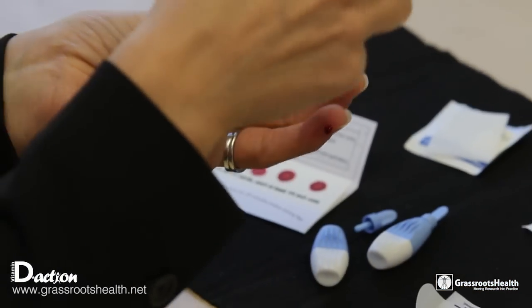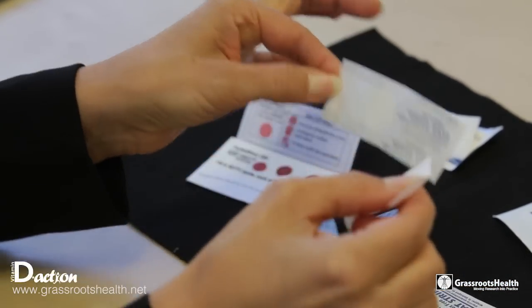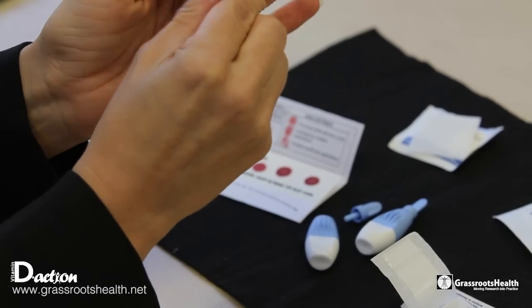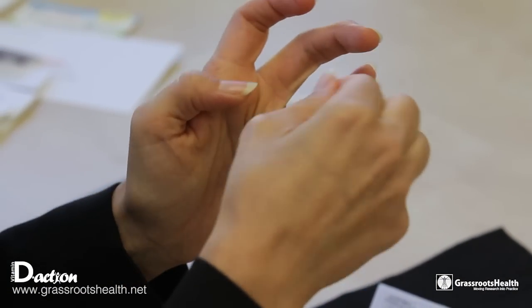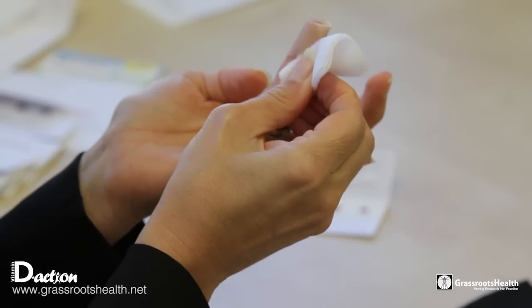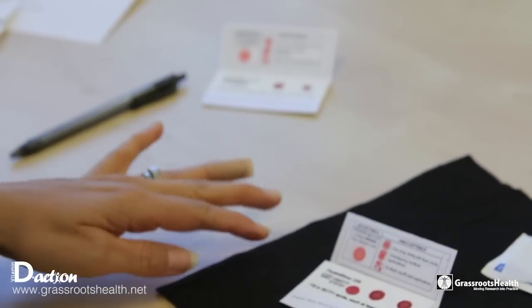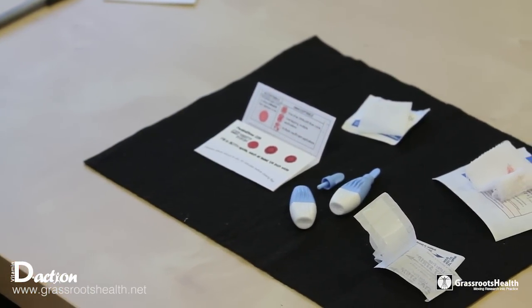Now we can apply the band-aid to your finger, which you can wear for 30 minutes or an hour or however long you wish, just to keep the blood from flowing. Once you have done all this, the next step will be to set your blood spot card aside and let it dry for approximately 30 minutes.